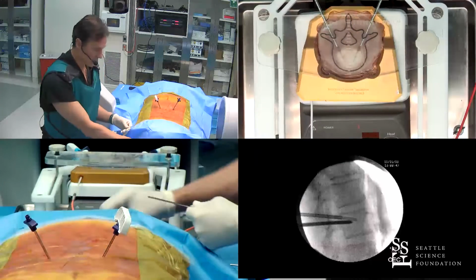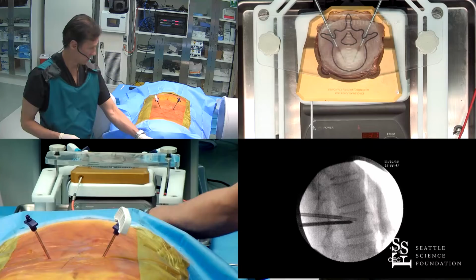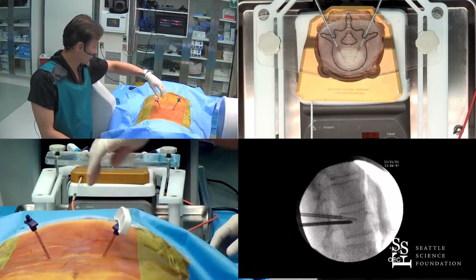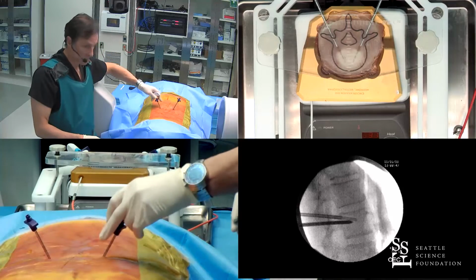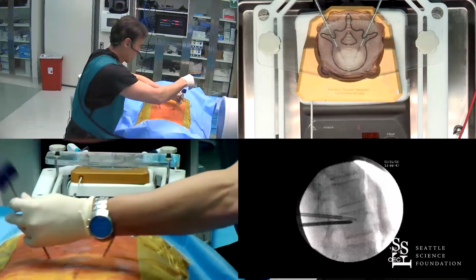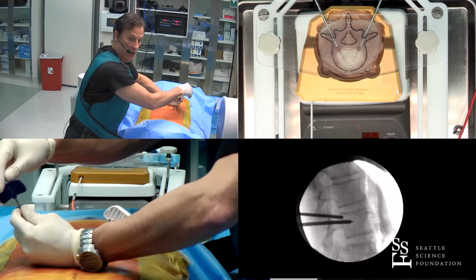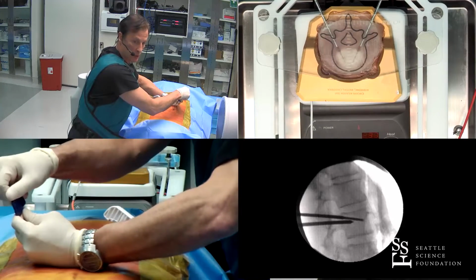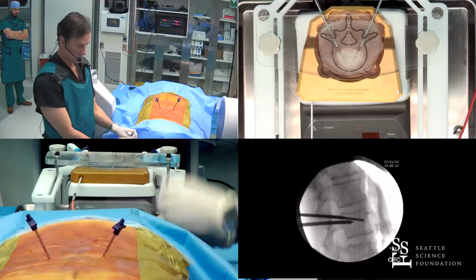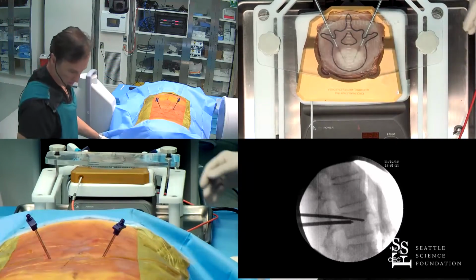So I always want to take a biopsy when dealing with a tumor case, or an infection. The old adage is biopsy all infections and culture all tumors. I meant to say it like that because they're very difficult to distinguish one from the other quite often. So I'll drill all the way out to the anterior portion of the vertebral body, and I will put the tumor ablation needles in so you can see it.